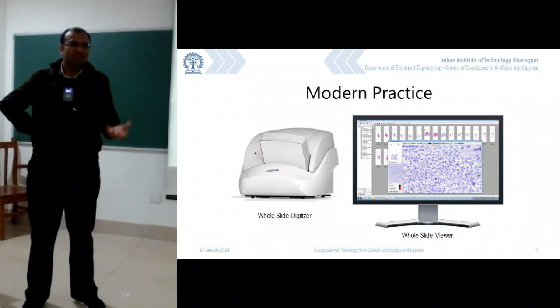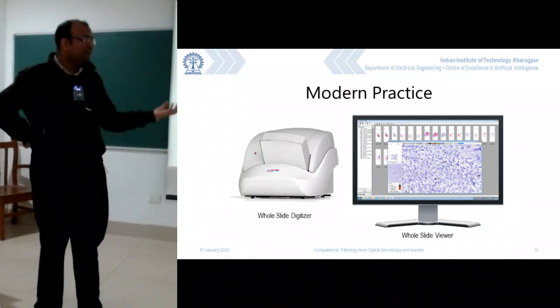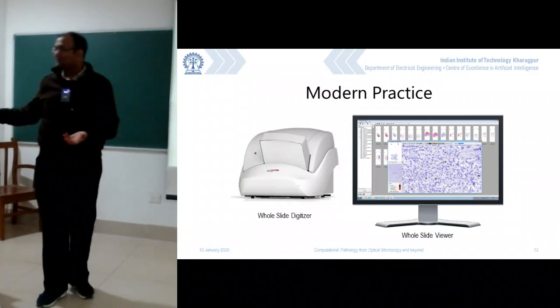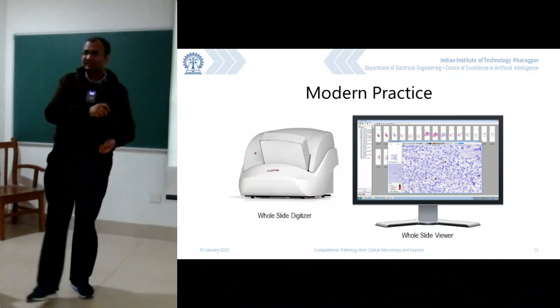It depends: a hematology slide is 200 rupees, nothing more than that. A histopath slide is going to cost you 2000, 5000 or something like that, and then you see that you are going to make a good amount of money by just reading one slide. Otherwise, what is 5000 rupees? You would need to read 50 slides to make 5000 rupees possibly in the other case. So that has opened up all of these avenues because you have these kinds of scanners.